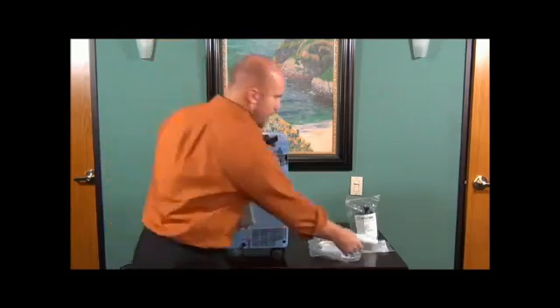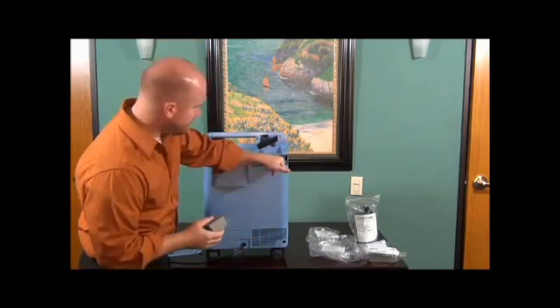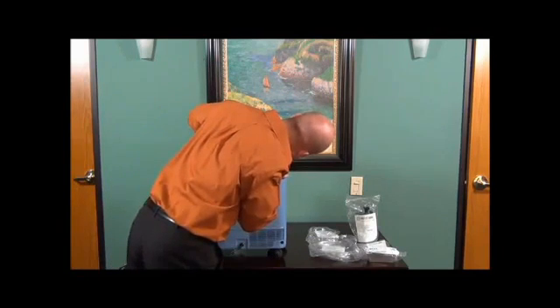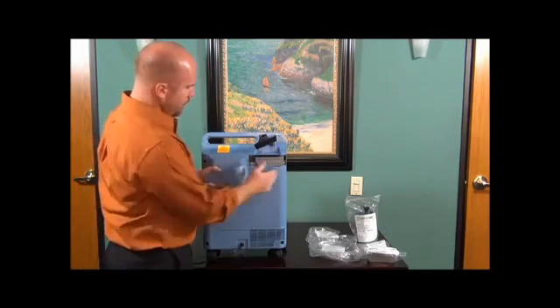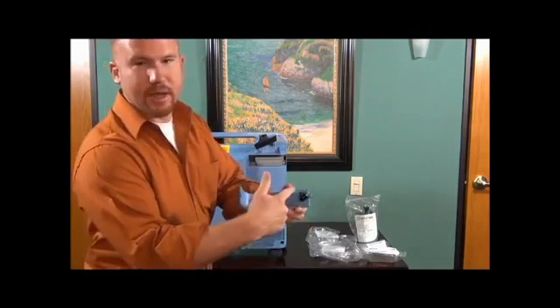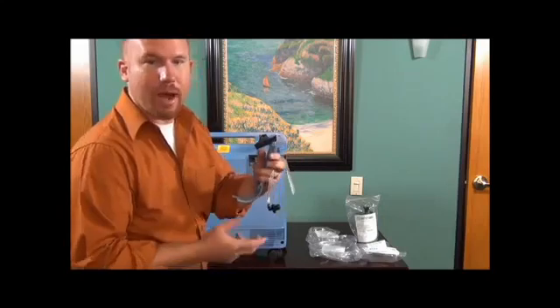So once you take it right out of the package, you'll put it right back on. You see this little knob right here on the end of the filter. You'll see a hole right there. That knob goes right inside that hole, and you pop it right in. Once it's popped in, you're going to want to put your cover right back on to your compartment. But while we have this open, you'll see back here is this rubber hose. You want to take that rubber hose out because this is how you attach your humidifier bottle.